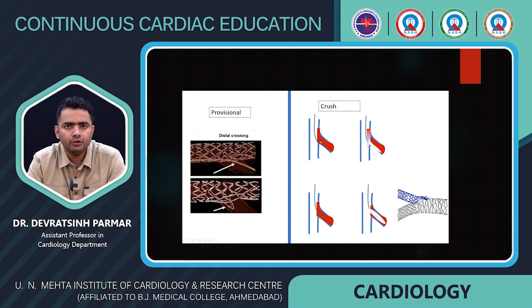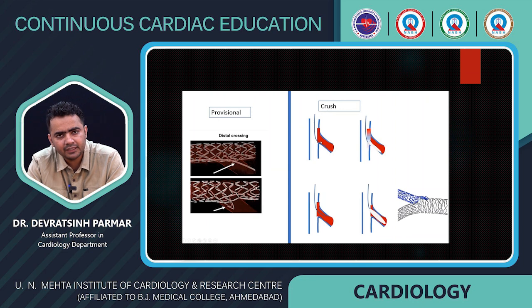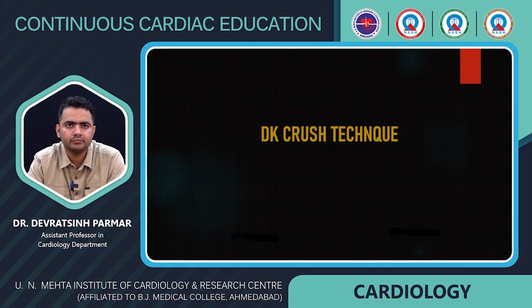Okay. We already discussed that rewiring the side branch is very important, and usually you should rewire through your distal struts to prevent deformation of the stents.